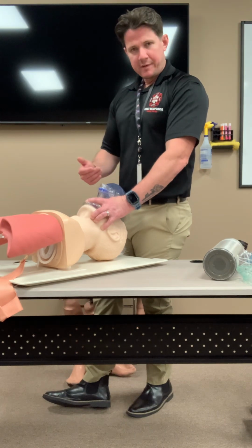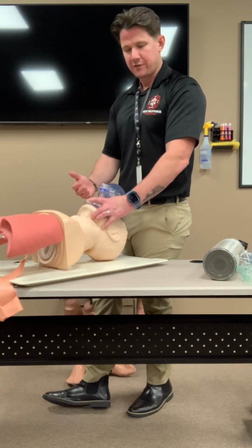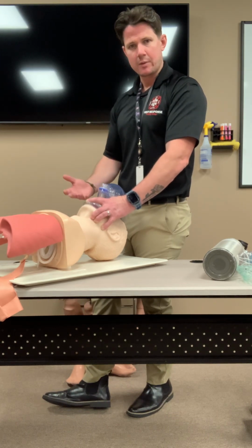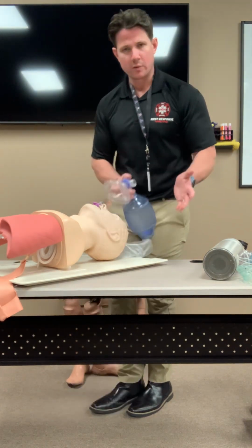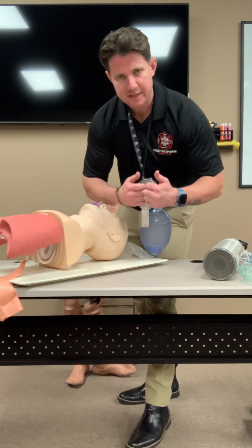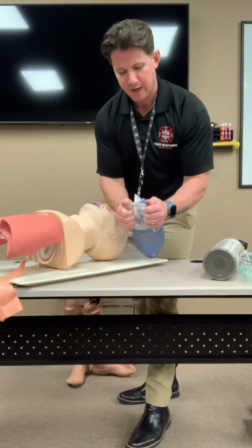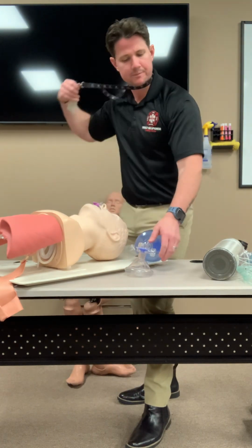A big thing where we fail is mask placement, right? And our technique for anchoring the jaw and keeping that airway open, right? So what I would tell you to do, either way, whether you're by yourself or a 2-person, whenever you're going to place this on the patient's face, all right, take your mask and pull it apart, right? This is elastic. So when I let go of it, it's going to want to recoil back to formation, right?